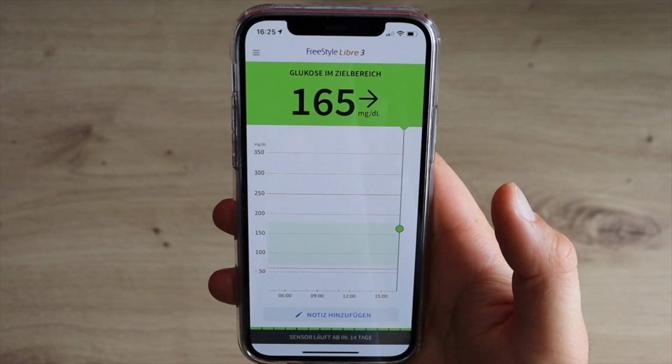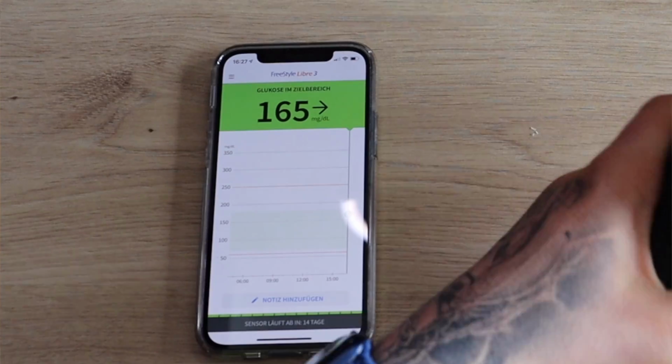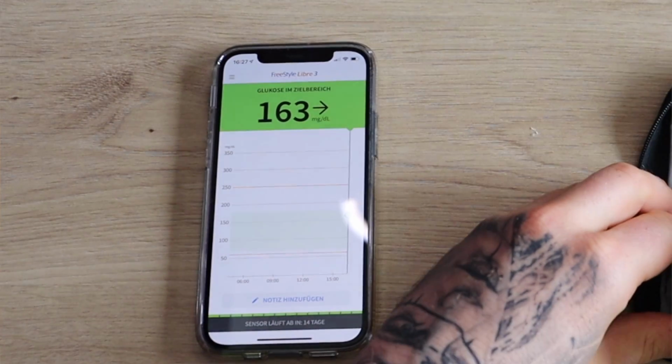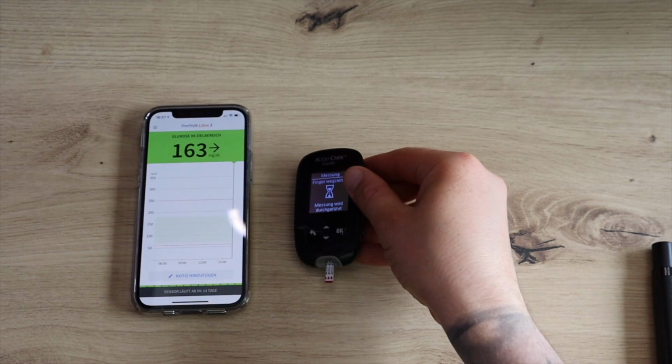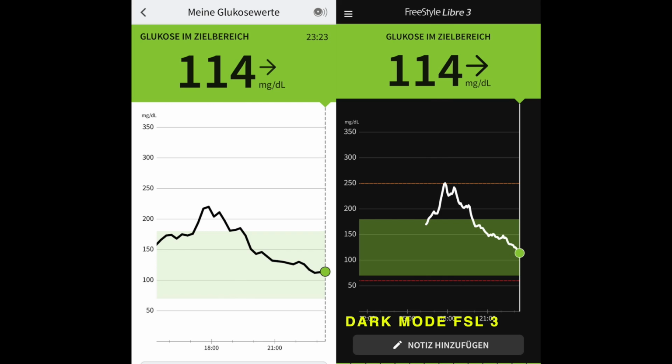I'm really curious how this new app will look. If you watched my FreeStyle Libre 3 unboxing video, then you probably know that Libre 3 also has a new app, but the app is very similar to the Libre Link app. One of the users who already tested the Libre 3 app hasn't seen many improvements other than a dark mode and the fact that the app now displays the glucose readings minute by minute.